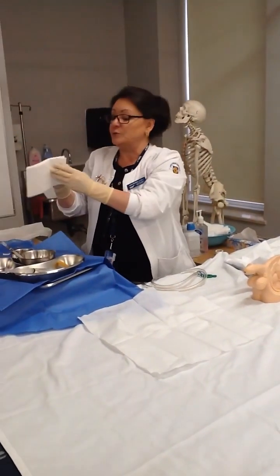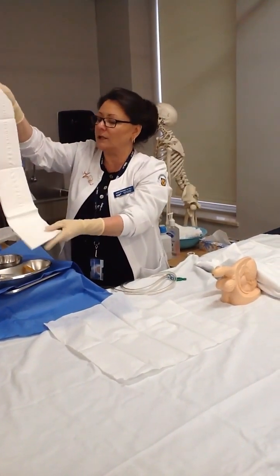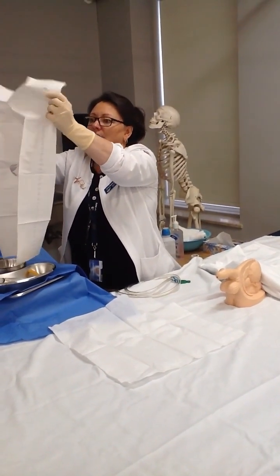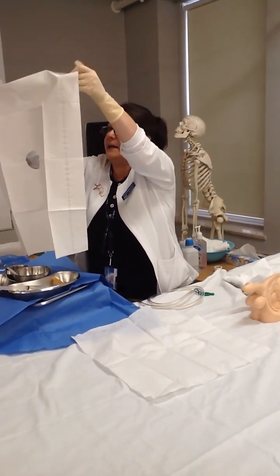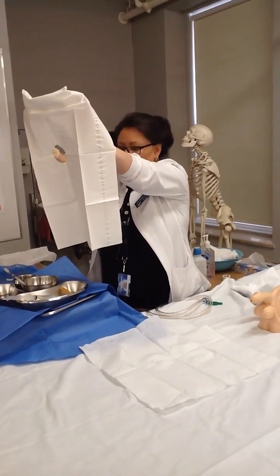Now I'm ready to put on my next drape, which is the fenestrated drape. It's got a hole in it so that we can narrow in on the area that we're focusing on. I'm opening that up over my sterile tray, and again my hands are up near the top, protecting my sterile gloves.